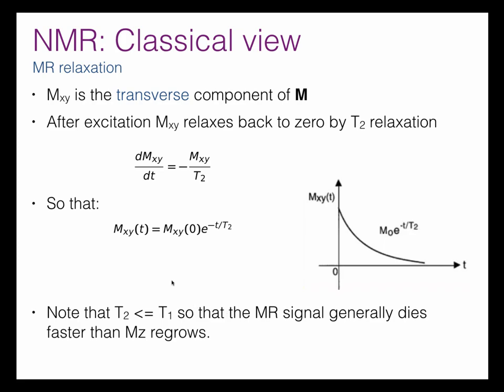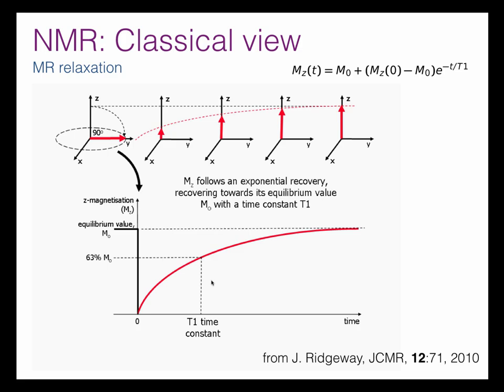So if you think about the magnetization vector, it's not like it rotates. When we initially tipped it down like this, the magnetization tip would have followed the sort of arc of a circle as it came down, assuming we tipped it quickly enough. But when it decays back, it doesn't decay back along the same path. It typically shrinks a lot faster in MXY than it grows back along MZ. So it follows some kind of course like this.